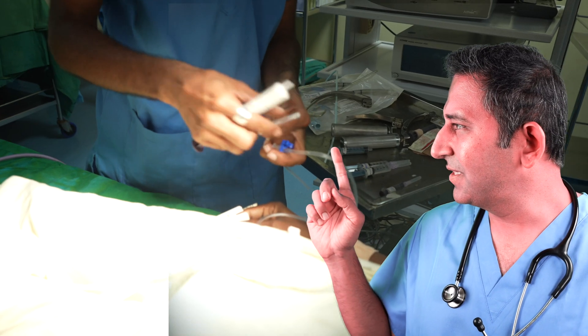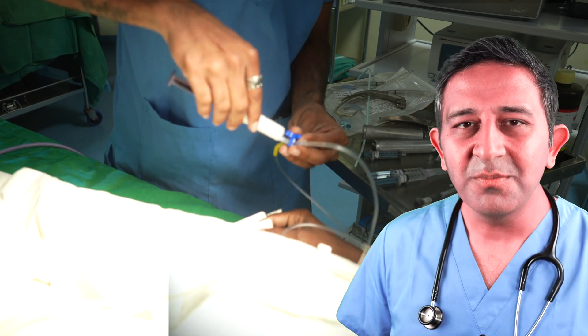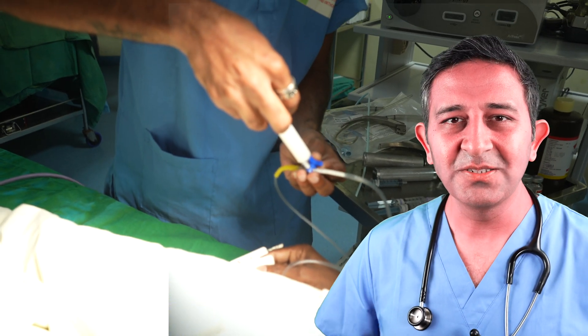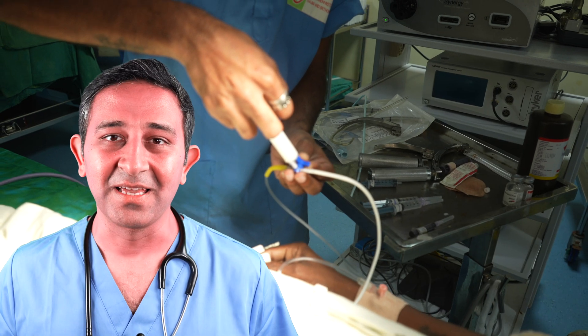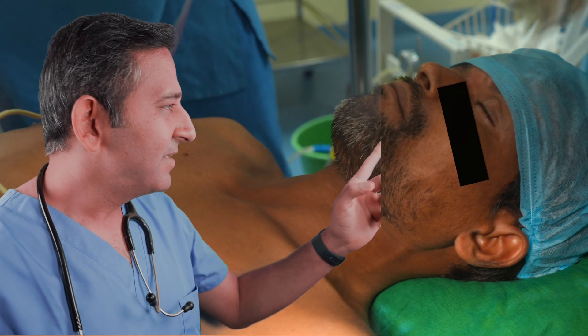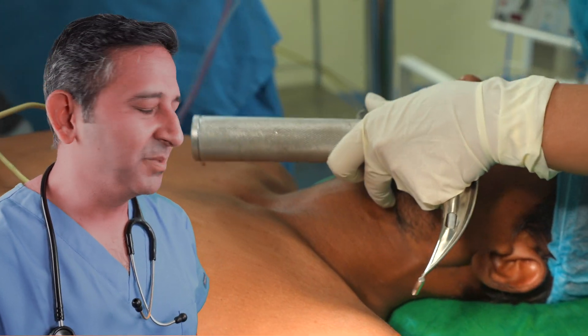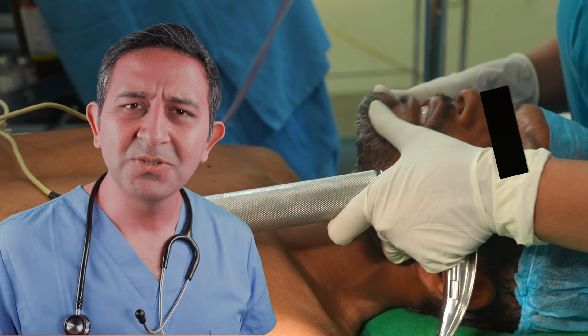This white thing here is called Propofol. Propofol is the commonly used general anesthesia medicine to get patients off to sleep. This black thing on the face is called an anesthesia face mask. Here the anesthesiologist is trying to get the breathing tube in, but the mouth cannot be opened because the jaw is broken.